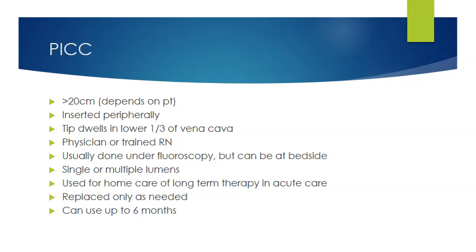We replace them only as needed, and we can use them up to 6 months. So we would only replace a PICC if the patient was done with the therapy and didn't need it anymore, or if the site became infected or something happened to the catheter itself.